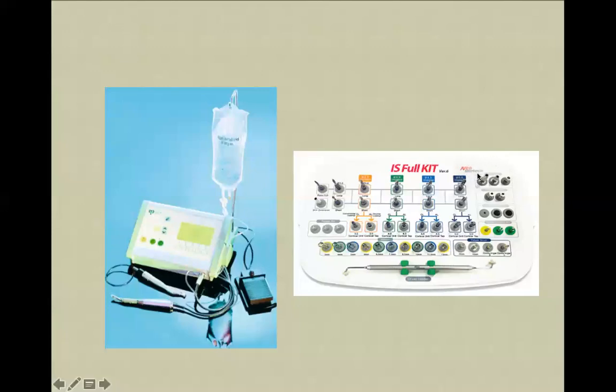It is South Korean production, and it cannot be used for the German implants, for example, because they have different thread designs. They have different diameters. They have different protocols. And if you mix it up, you might face a great amount of complications.